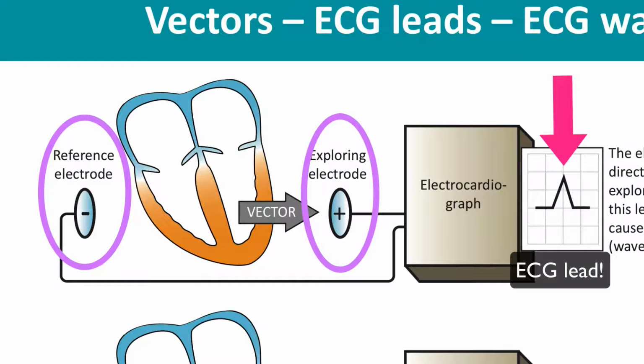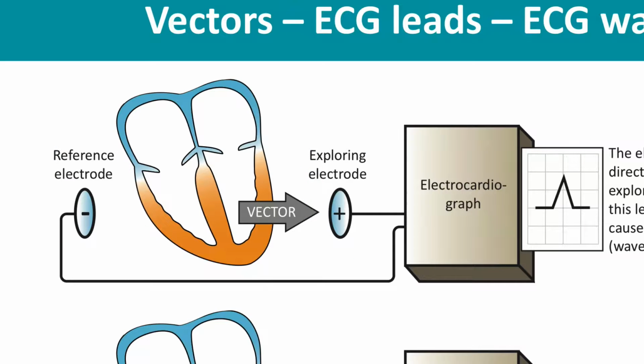These electrodes will generate the ECG curve by analyzing the electrical vectors which exist during the cardiac cycle. And the electrocardiograph, that is the ECG machine, has a very simple construction. One of the electrodes is programmed as positive, and the other is the negative electrode.